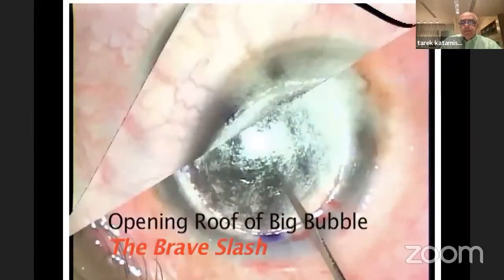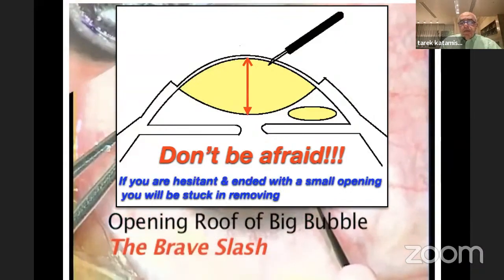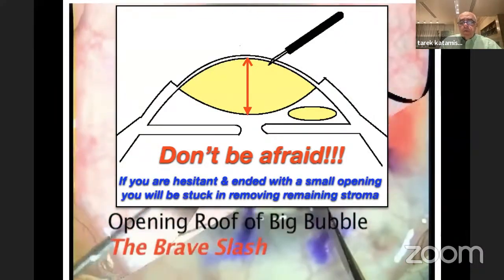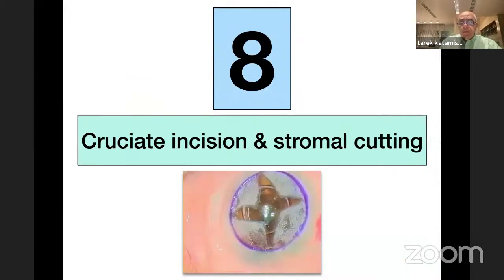As I always say, don't be afraid. The distance between the stroma, the roof, and the floor is very large. And if you are hesitant and end with a small, tiny opening, you will be stuck in removing the remaining stroma. The second step after this is cruciate incision and stromal cutting.